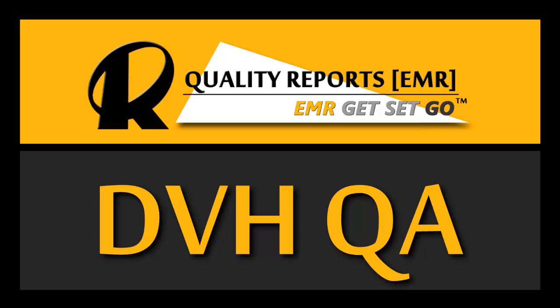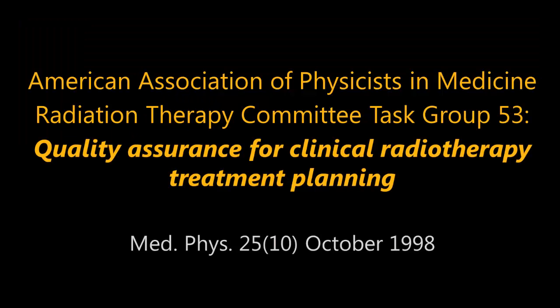But let's discuss more fully how valuable it is to do independent checks of DVH generation, and then explore an intuitive and powerful tool built into Quality Reports that's dedicated specifically for this task.